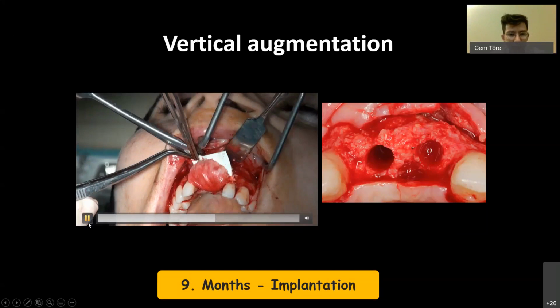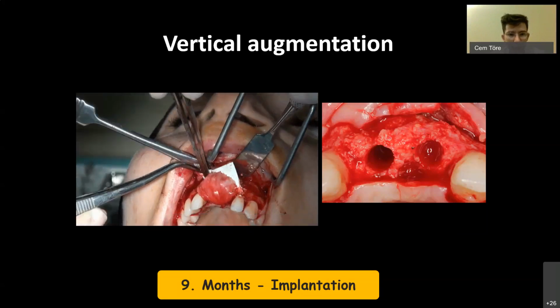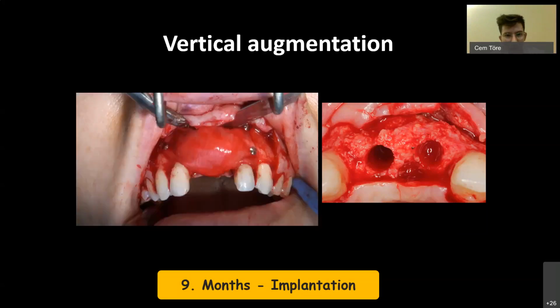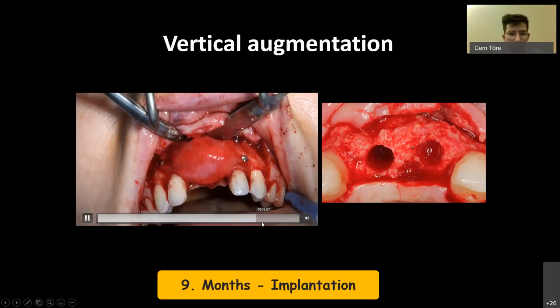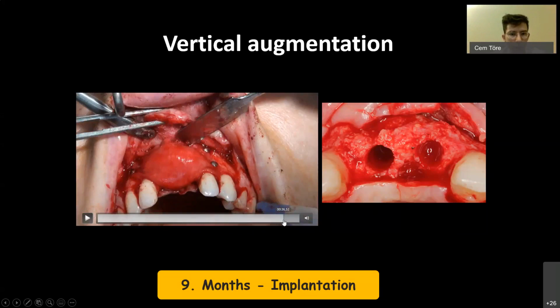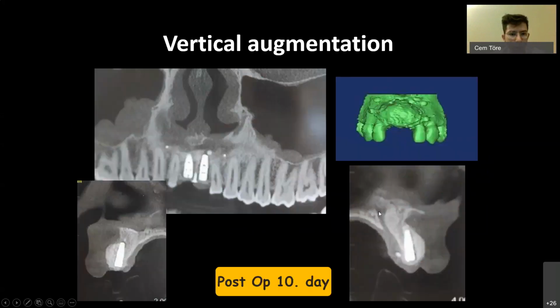For this, we just needed a collagen membrane because we are augmenting laterally. Our pin's in place, our membrane is taut, and then we have closed. This is the 10th day post-operation. Look at this beautiful buccal bone on both sides, both implants.